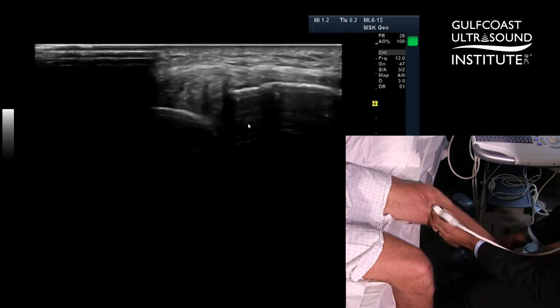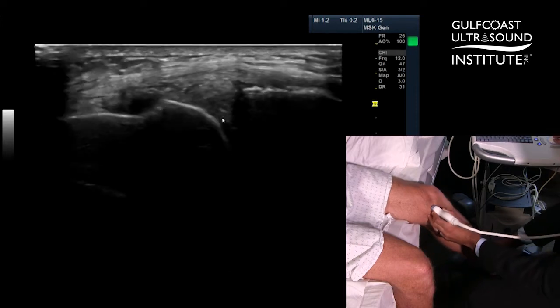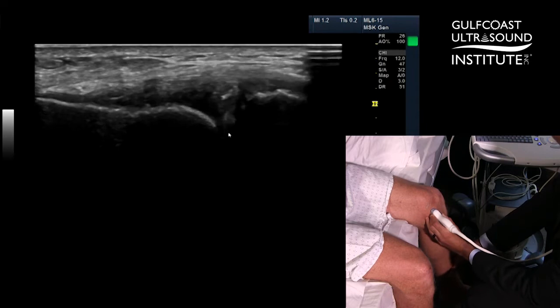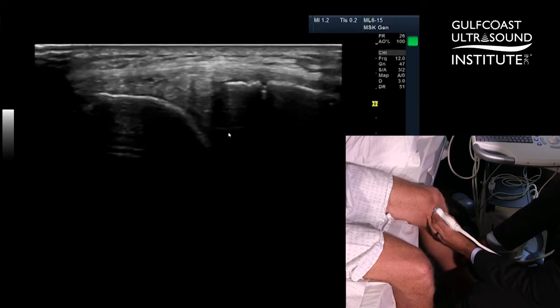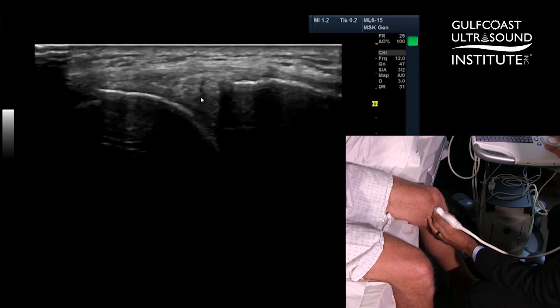And you can see here, moving back and forth, there is mild subluxation of the medial meniscus with interstitial tearing right here. This same technique can be performed on the lateral aspect of the knee when interrogating the lateral meniscus as well.